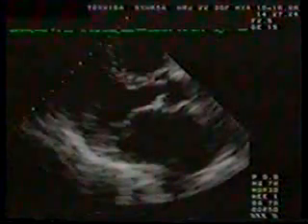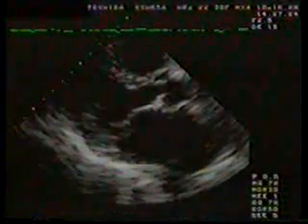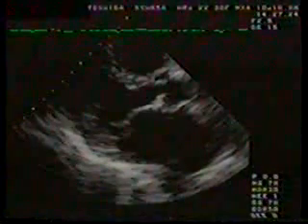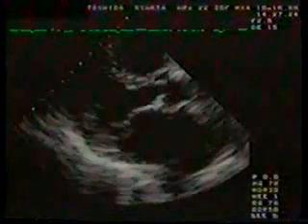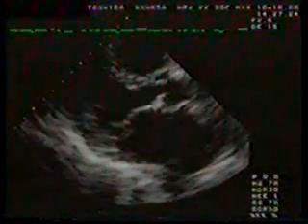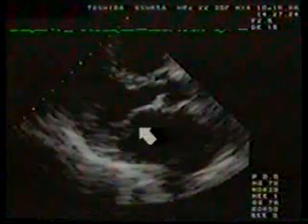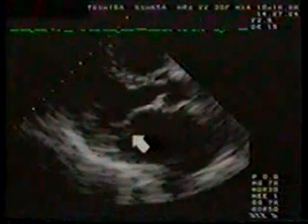Earlier in this tape, we demonstrated a case in which pulsed wave mapping was used to delineate anterior baffling of a mitral regurgitant jet. This baffling phenomenon is most easily appreciated by color flow imaging. This is a parasternal long axis frame. The mitral leaflets appear redundant. The posterior leaflet has moved beyond the anterior into the left atrium.